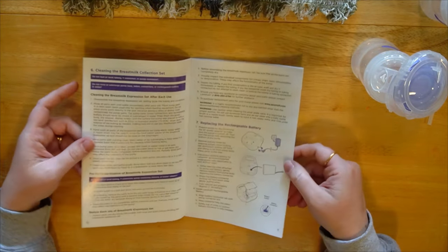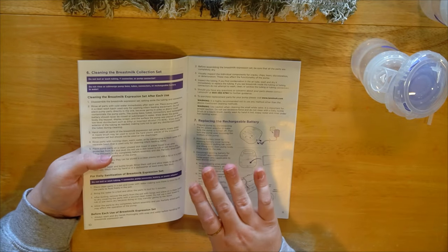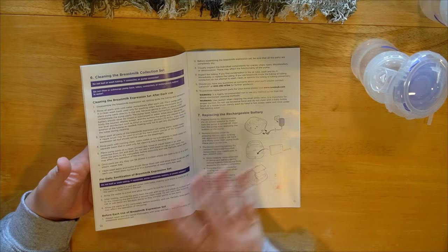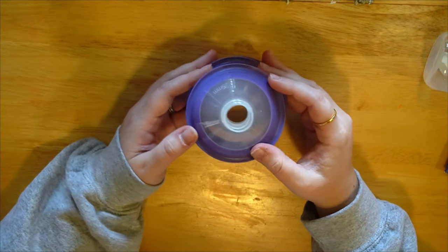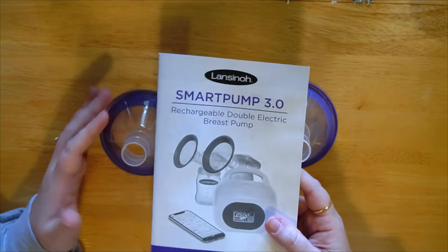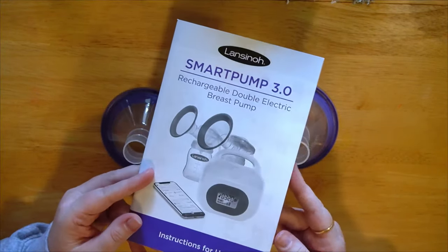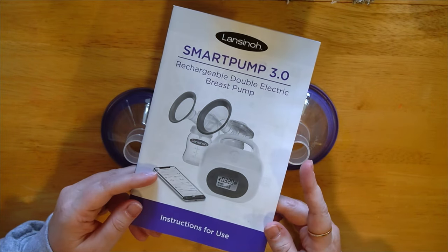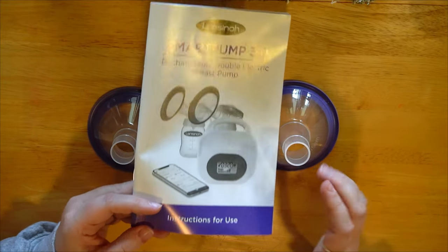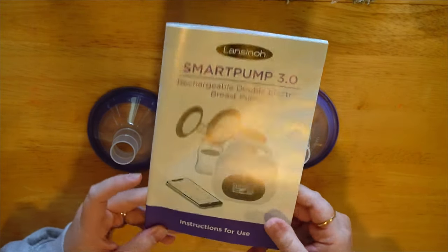If you're using this pump for a long time and the battery just isn't working as well, it's as easy as getting a replacement and switching it out. If I can find a PDF online version of the manual I will definitely link it because it's got a lot of great stuff in there. First things first, I want to quickly talk flange size — the manual has a great reference with pictures and everything.